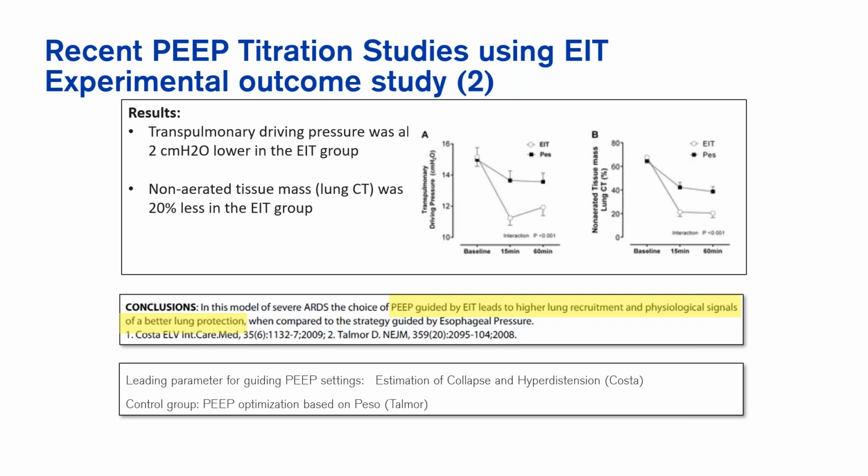Of course, now there is research available on real patients as well, and especially there is a lot of evidence when it comes to COVID-19 patients, and I'm going to cover this in the next webinar. But we already see that even in the ARDS models, we see a significant improvement in the optimization of the ventilation guided by EIT.